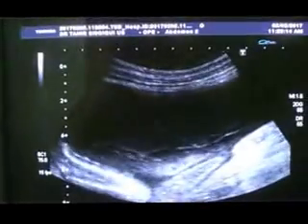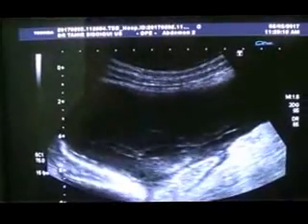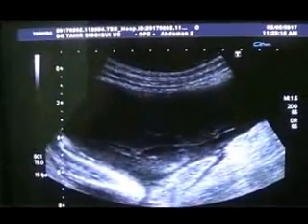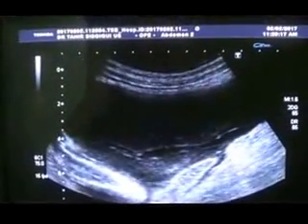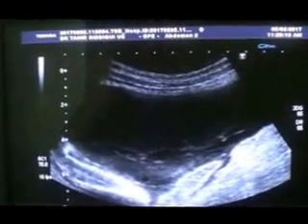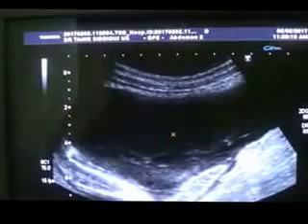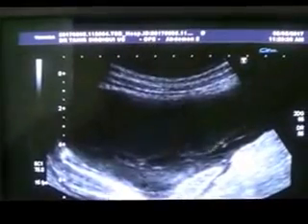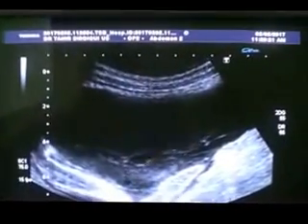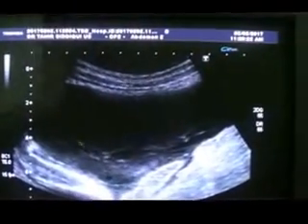If I keep the probe over there, you can see — these are septa, these are septations within the fluid.